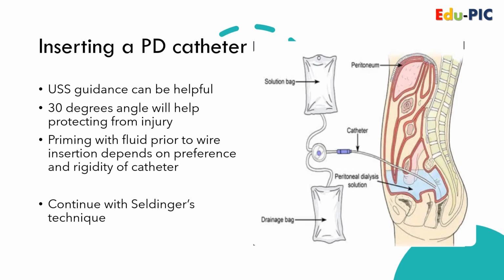Right? As soon as you've put your catheter in, you need to remember to connect it right away to the closed circuit that your nursing team has prepped for you. And then you can start your PD process.